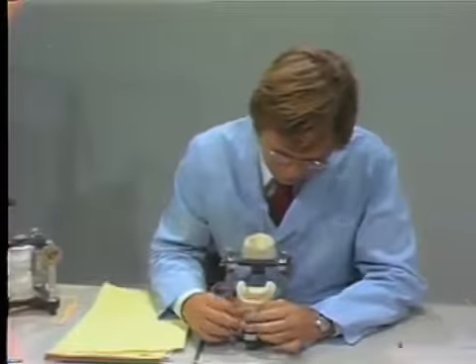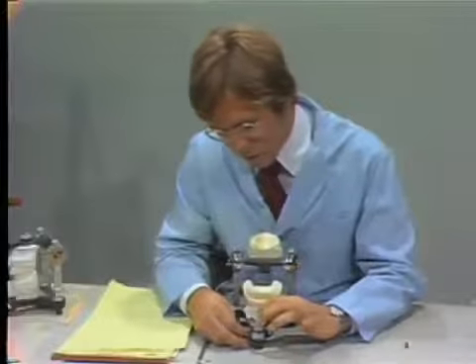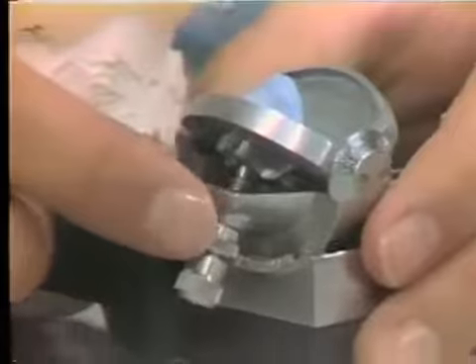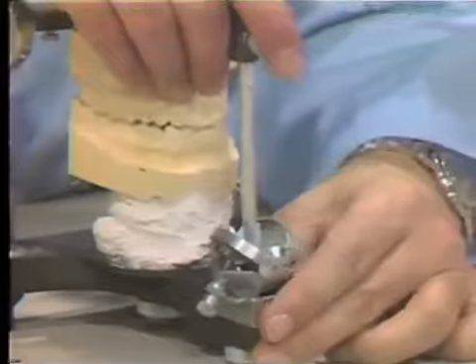This can be repositioned into the articulator and positioned with sticky wax, probably would be the best thing, or a compound of some sort to hold it in position. I'm now raising the lateral wings to hold our finished product, and at that stage I'm also going to use this little thumb set screw to lock that lateral wing in position. And also it's the same thing for the other side. Now we have our customized acrylic guide for both the lateral excursions and the protrusive excursion.